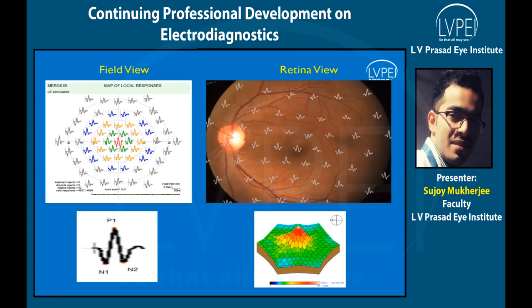Srikant, just wanted to hear from Richa and then Tapas, please. Okay. For anything with glaucoma, you want to assess ganglion cells. We did not speak about this in this particular CPD, but pattern ERG would be your choice, or photopic negative response. Those are the two tests which you often use for ganglion cell assessment.